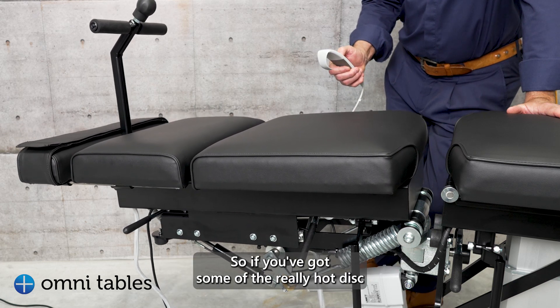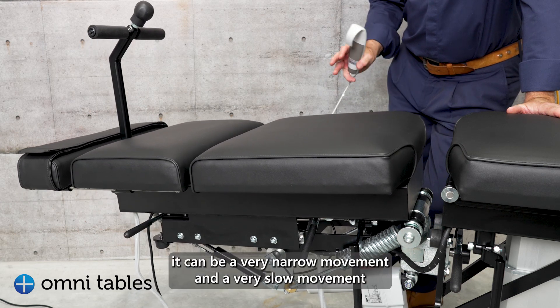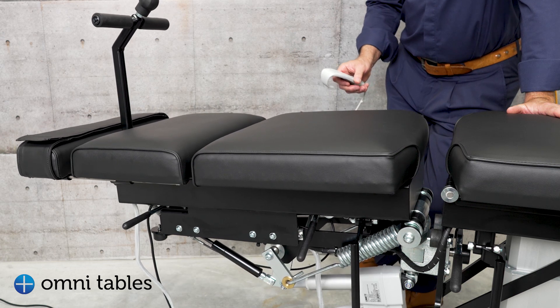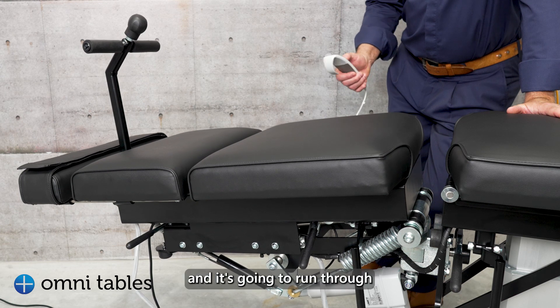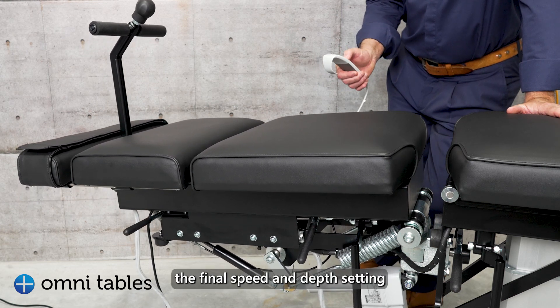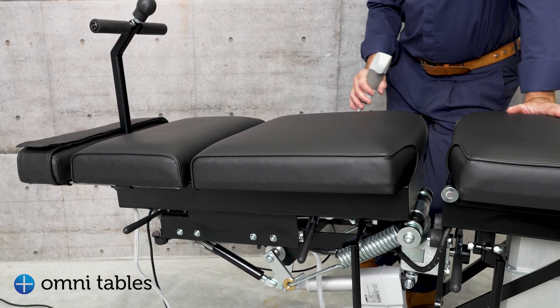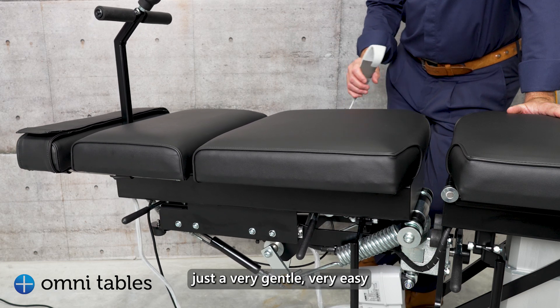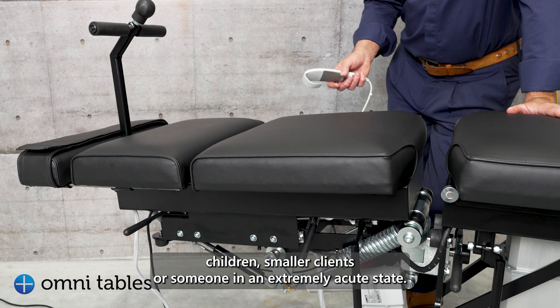So if you've got someone with a really hot disc or quite acute presentation, it can be a very narrow movement and a very slow movement. I'm just going to run through the final speed and depth setting — just very gentle and easy for children, smaller clients, or someone in an extreme acute state.